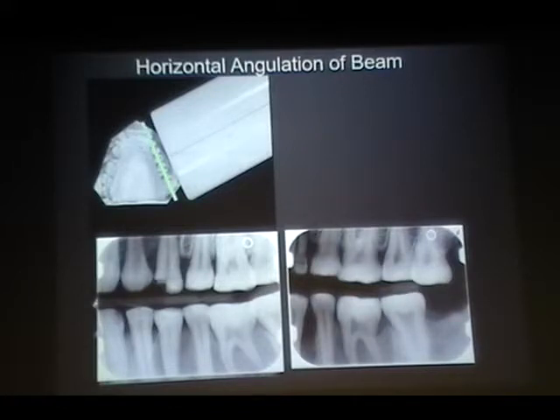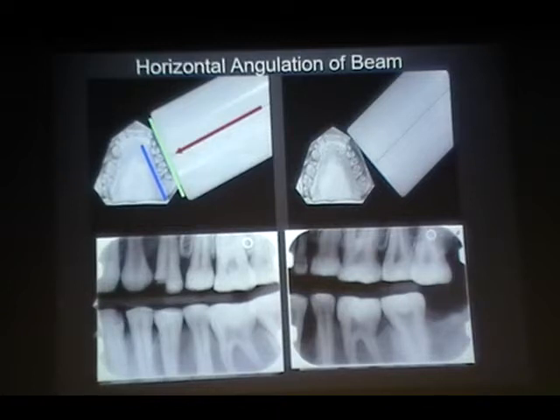So you do place the sensor pretty much like that, and they're parallel. And perpendicular to that, you'll release X-rays. If you want to open the contact here, you do make a slight change.